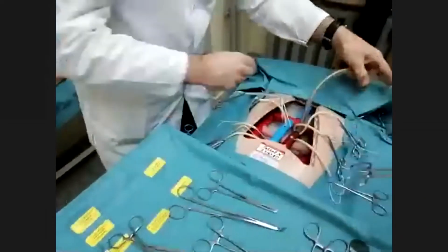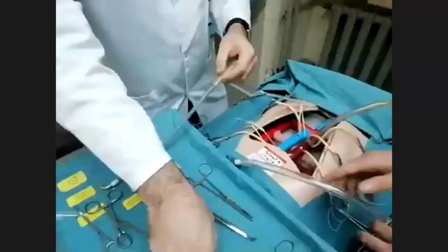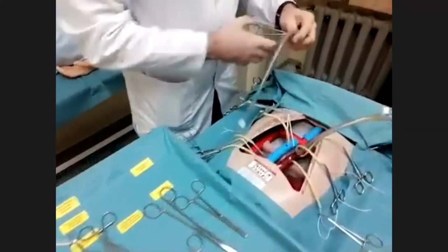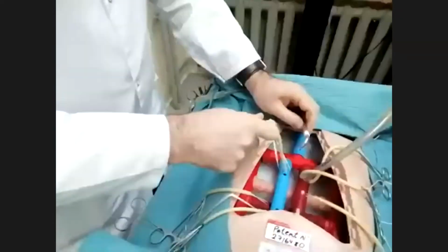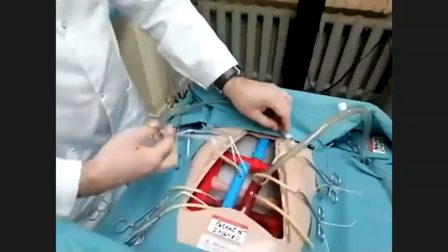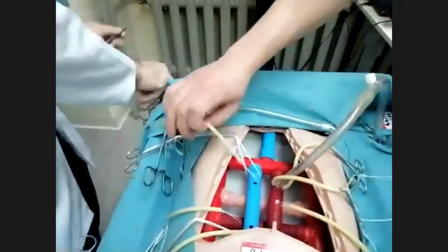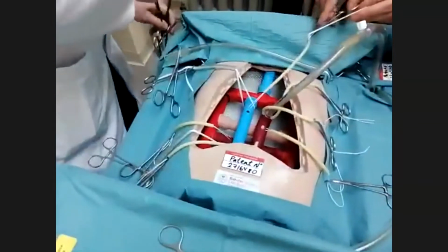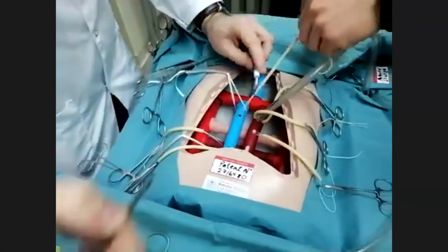After that, I take the venous cannula to the superior vena cava. This is a hole for cannulation. Before the cannulation, I have to put 4 purse-string stitches here, and then take the cannula, scalpel.